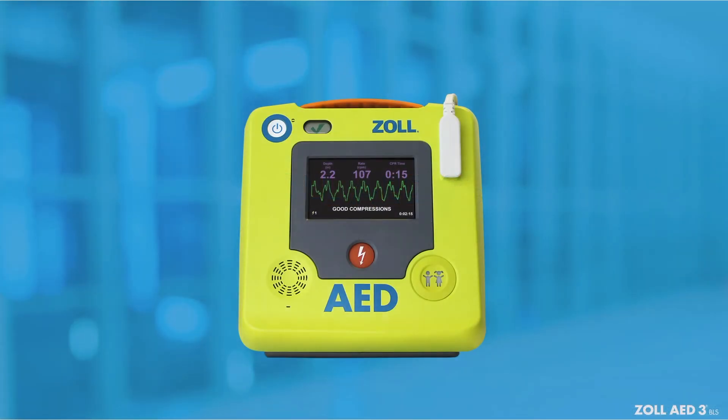The Zoll AED-3BLS builds on our reputation for providing rescuers with unmatched support, and it embodies all the same great qualities of its predecessor while offering advanced features to provide unrivaled rescuer support. Before we begin our video tutorial, let's take a look at the components of the device.